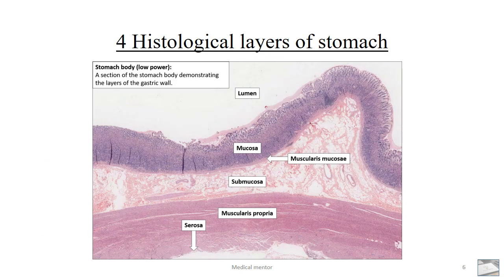The serosa is the outermost layer, which is derived from the peritoneum and is surfaced by mesothelial cells. These are the four histological layers of the stomach. The innermost is the mucosal layer, and the outer boundary of the mucosal layer is the muscularis mucosa. Then we have the submucosa, which is rich in connective tissues, blood vessels, and lymphatics. Under the submucosa we have the thick muscularis propria, and the outermost layer is the serosal layer.